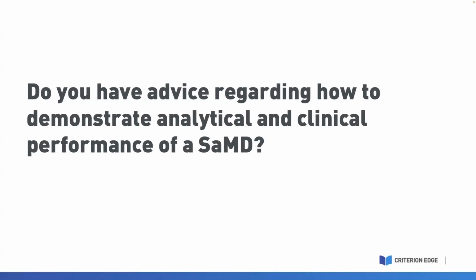In that case, you may not want to focus in on the accuracy of the diagnosis because that could be affected by any number of factors outside of your software's role. But the performance of your software could be something as simple as the time to diagnosis, the ability to speed up the diagnostic process, the ability to identify or correlate with the accuracy of traditional methodologies.